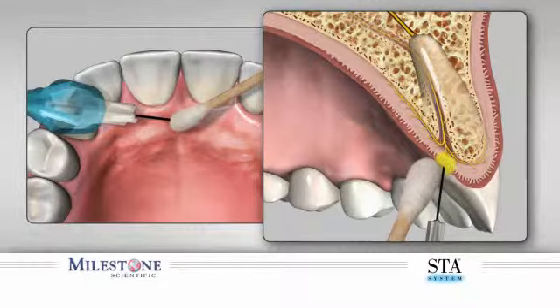The technique of allowing anesthetic to contact and diffuse through the outer layers of tissues produces a topical anesthetic effect, numbing the surface. Do not allow the needle to puncture the tissue at this time. Continue to allow the needle to stay on the surface for another 4 beeps before initiating needle penetration.